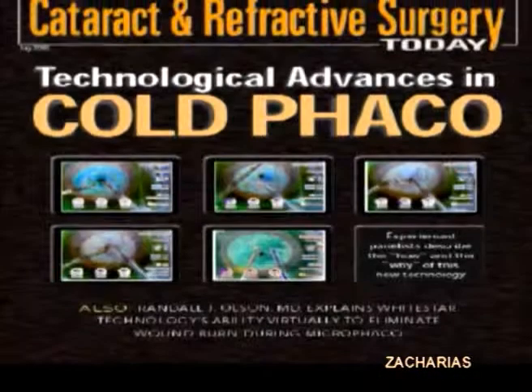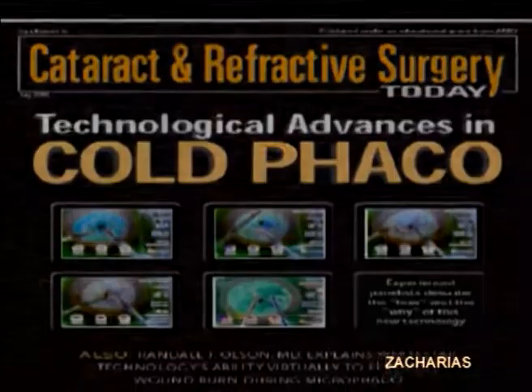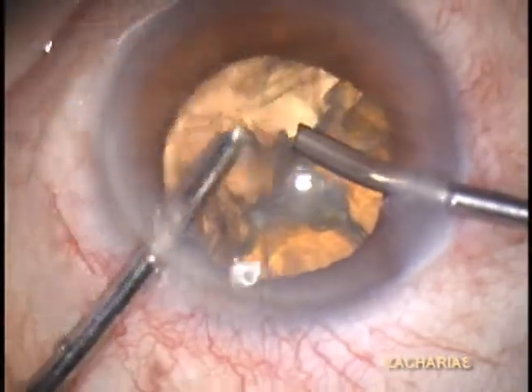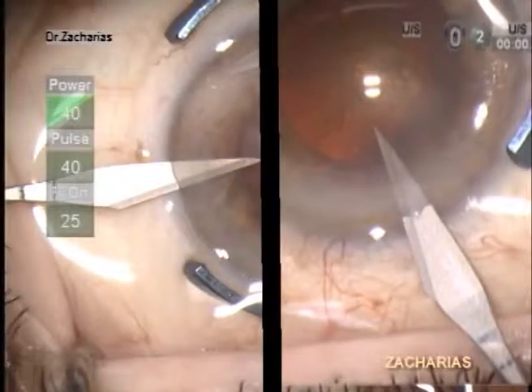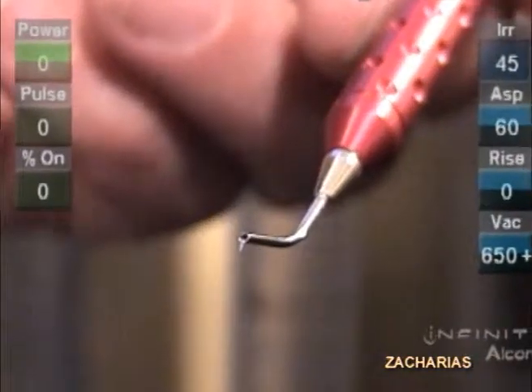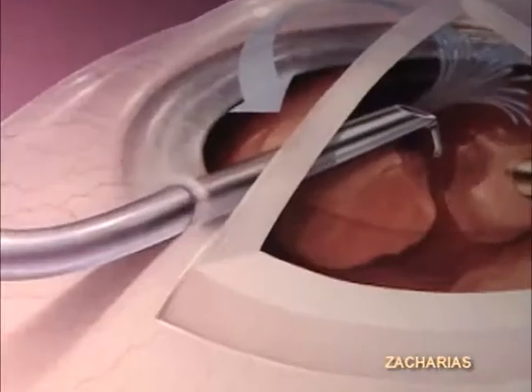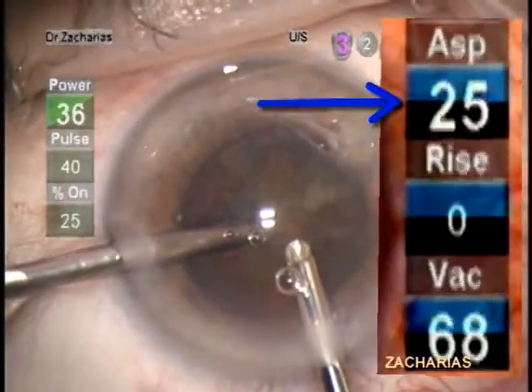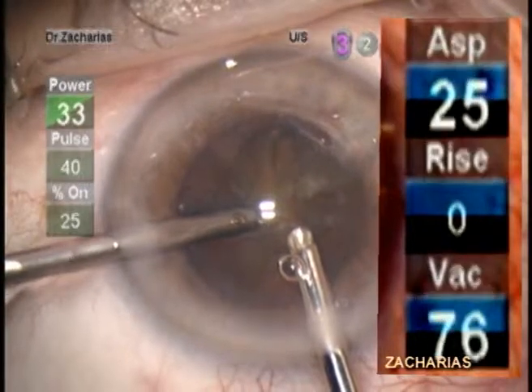This cold phaco concept has produced an increasing interest in micro-incision cataract surgery (MICS), where irrigation and aspiration take place through separate, very small incisions. Reduction of irrigation port dimensions limits inflow capacity and produces anterior chamber instability. Low settings for aspiration rate and vacuum must be used to avoid complications.